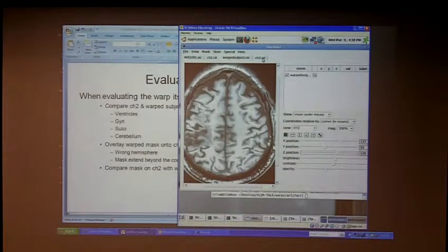But you don't think that, your inclination, Dan, would be to attribute it to different strategies of tracing the lesions as opposed to something that is systematically introduced by the warping? No, I'm more than positive this was not introduced by the warp, as the process doesn't stretch. What about the reliability between our lesion traces? Well, we did, but that was a moving target.